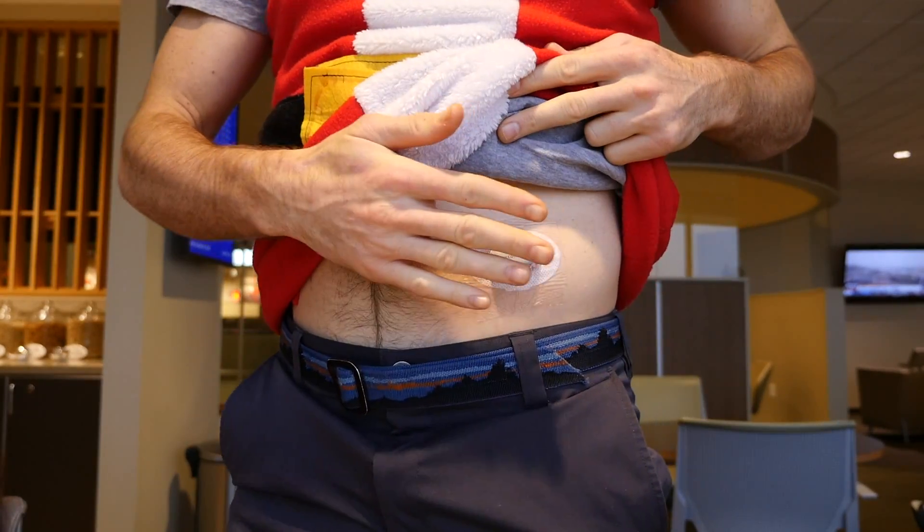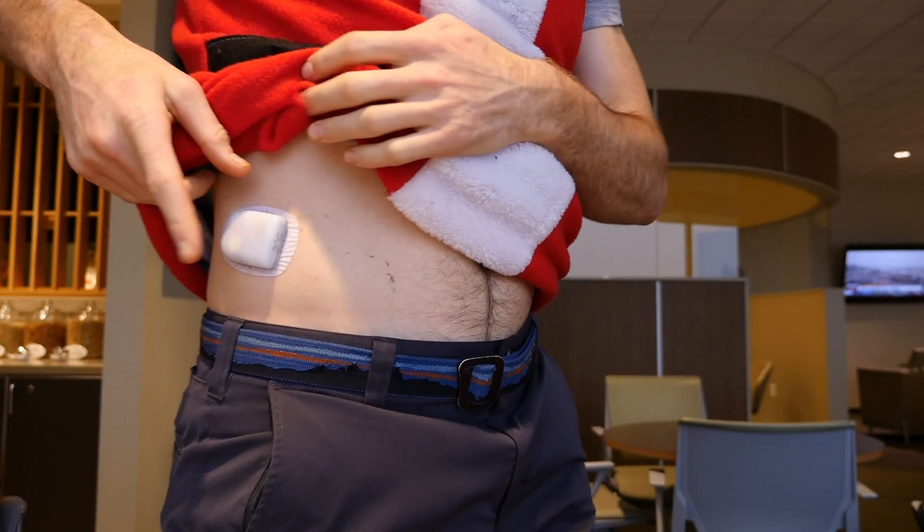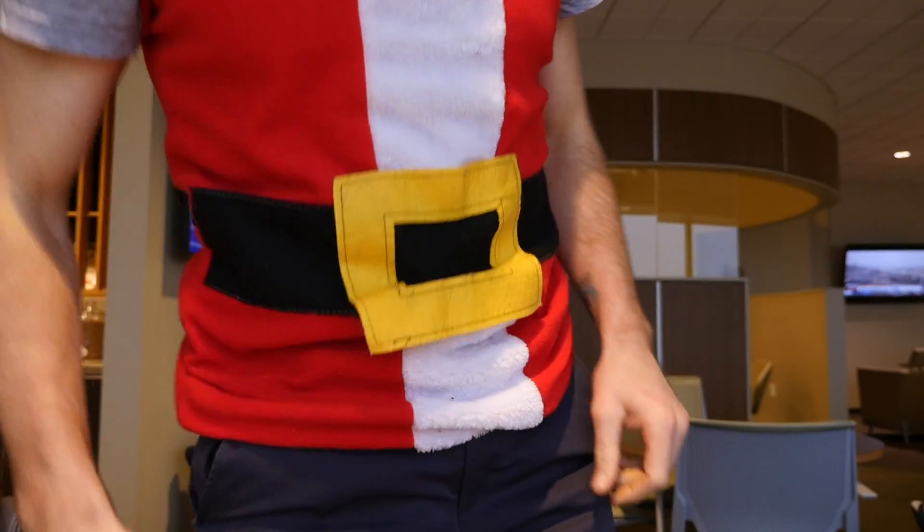Keep everything right here — I've got my sensor here and my pod there. That way, when you start beeping and the alarms are going off, you can just lift your shirt up a little bit. They might ask you to touch your pod, sensor, or pump, and then they'll swab your hand. It's a lot easier than having to pull your pants down like I did — that was really awkward. Having everything visible makes it nice and easy and gets you through airport security quickly.